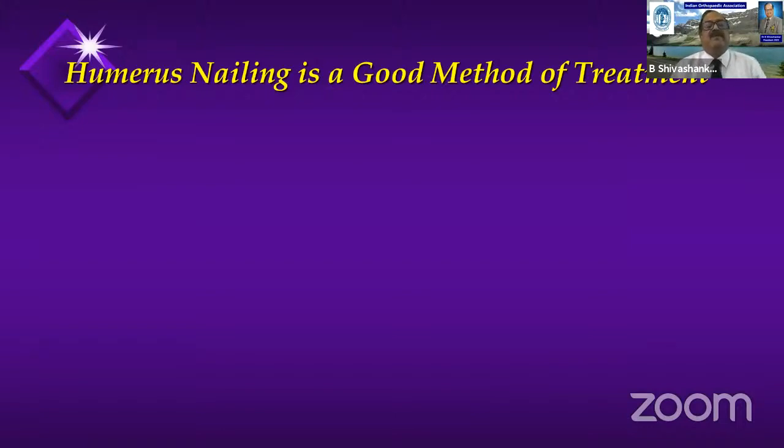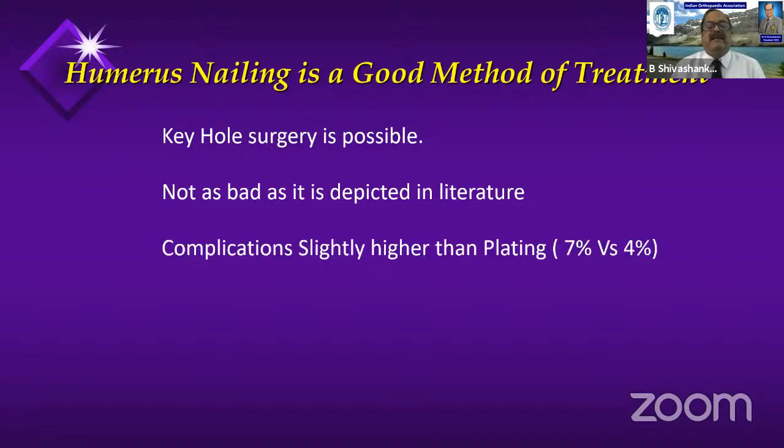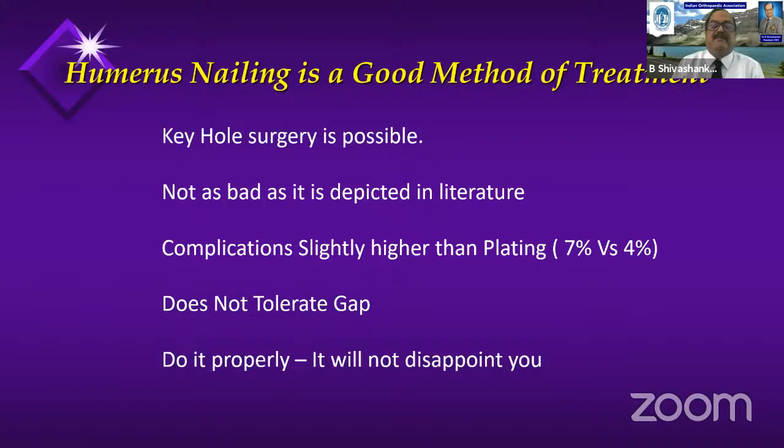Friends, to conclude, humerus nailing is a very good method of treatment. Keyhole surgery is possible, not as bad as depicted in the literature. Complications are slightly higher when compared to plating, and it does not tolerate gap. That has to be taken care of. Do it properly, and it will never disappoint you.